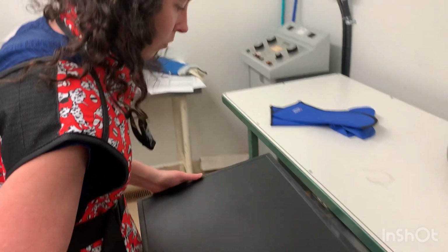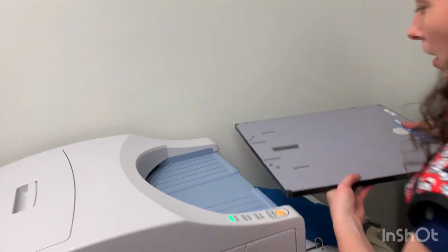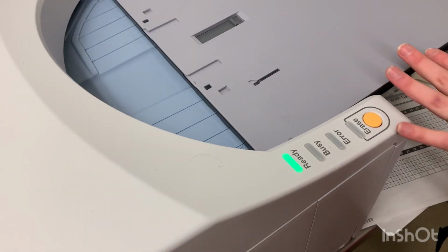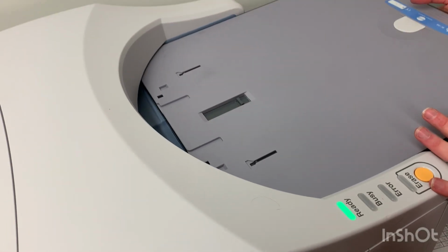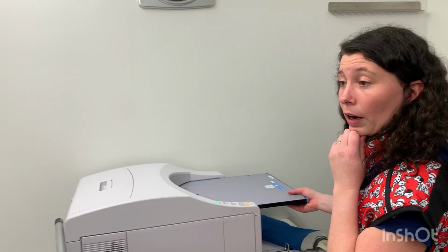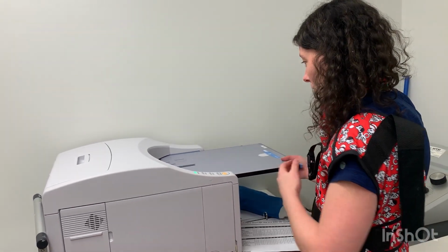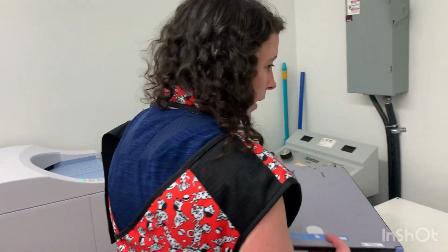Really important to be careful with these, don't drop them. And then it says ready. You can see the arrows in here. We would put it in here to be processed again and explain how that works. And then we would go over and take a look at our computer and see that we're happy with the image. So that's how we would go about that process. Then we would have those two images taken.